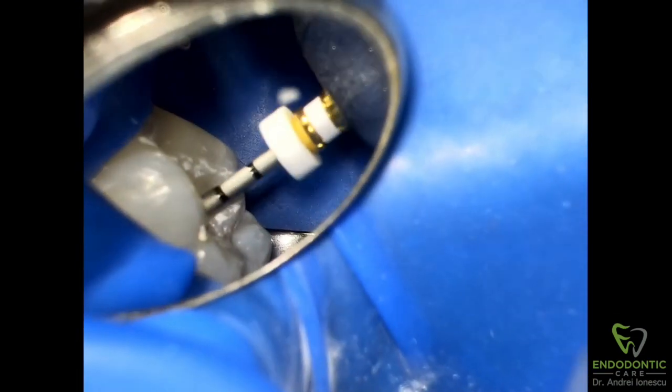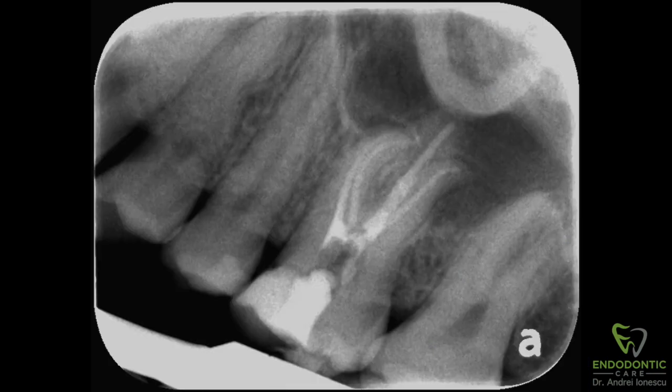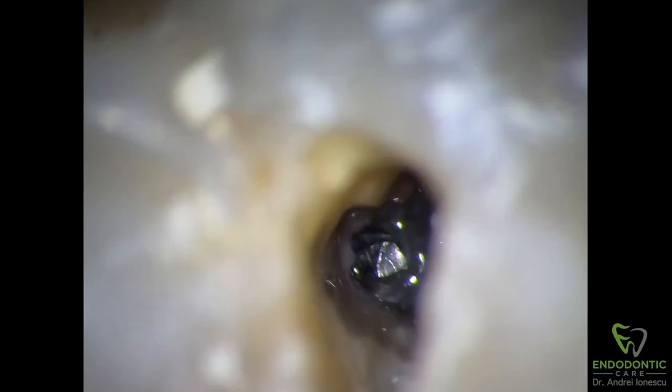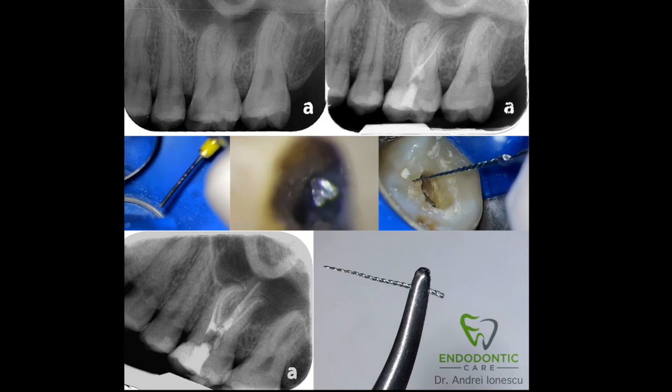I've used the IRS system multiple times. It's been successful most of the time, especially if the file is separated a little bit higher up — you probably have a better chance of grabbing onto it. This is our final x-ray. Even with the troughing that we did around the distal buccal canal orifice, I feel like we didn't remove that much tooth structure, and the tooth still has an excellent chance of success and an excellent prognosis. The IRS system is a very nice tool to have in your toolbox because these situations do happen, and it's just nice to know you can remove the file relatively painlessly. I hope you found this helpful — if you have any questions, leave them in the comments below and I will answer them. Thank you.